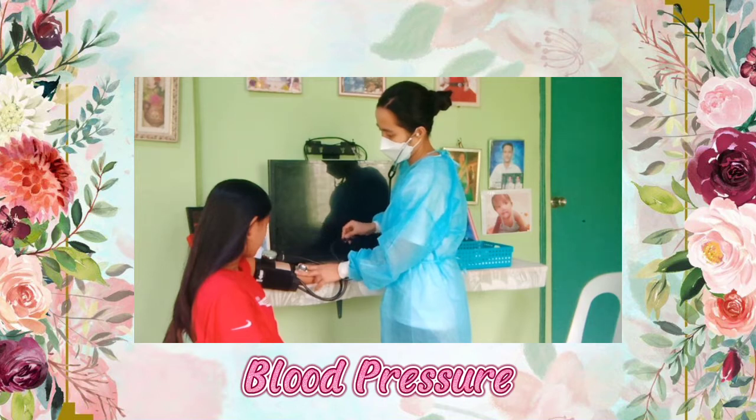Slowly release the pressure valve and allow the needle of the manometer gauge to fall at a rate of 2 to 3 mm of mercury per second. Note the point on the manometer when you hear the first clear sound and continue to deflate the cuff, noting the point at which a muffled or damped sound appears.